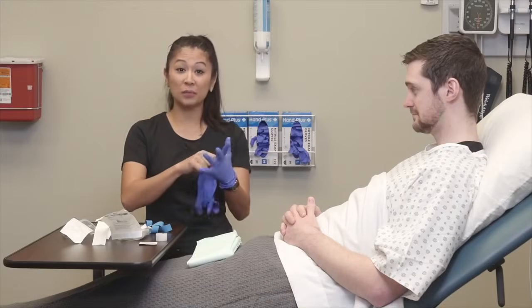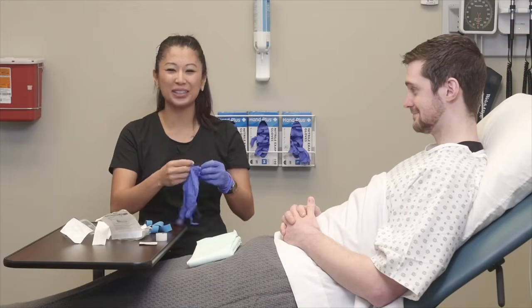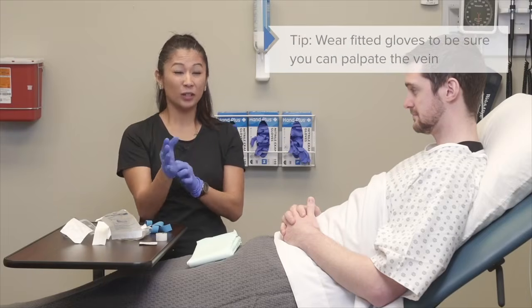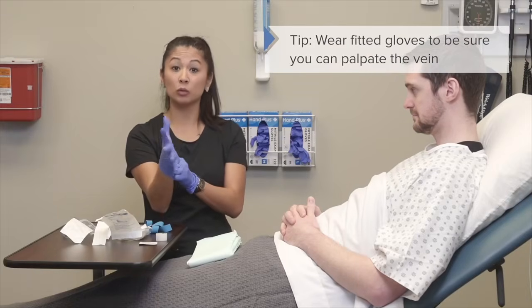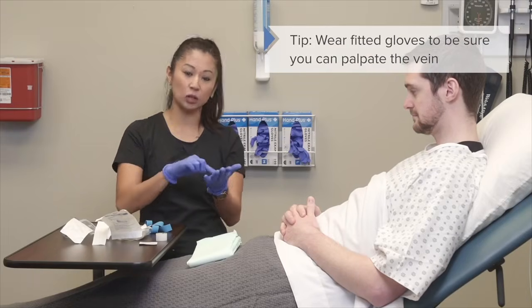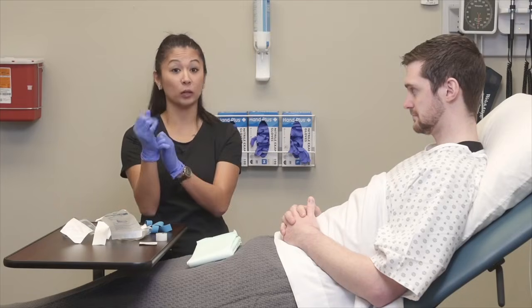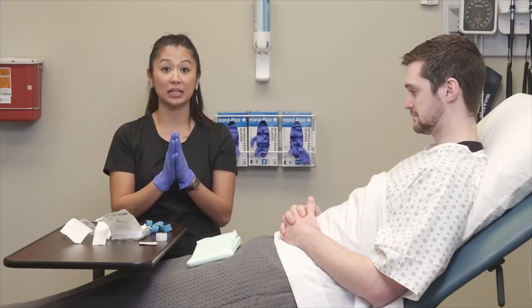All right, so here's something also to know about gloves, especially when they bunch up like this. So with a skill like IV, you really don't want gloves that are too loose because that may make it difficult to palpate or feel the vein. So it's nice to have some that are a little bit snug as well. So that's something to consider.